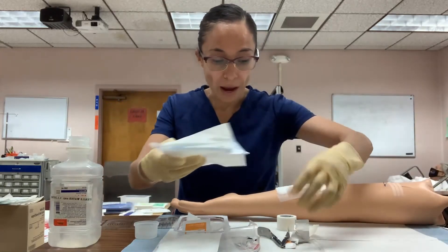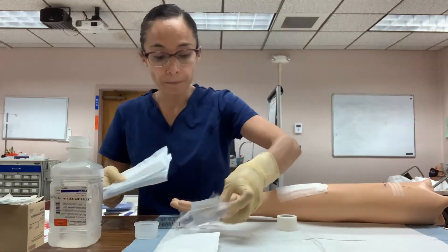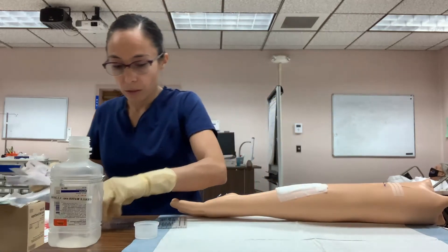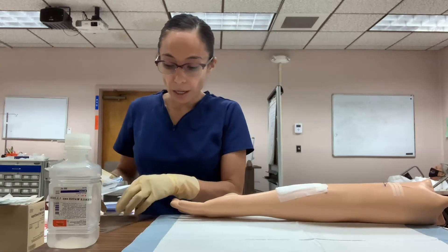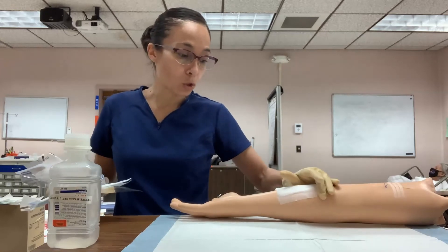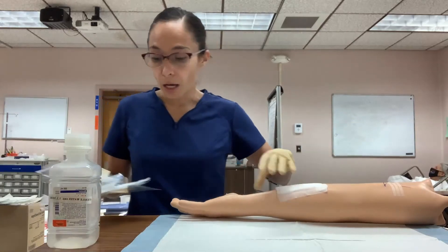Pick up all the trash, count the staples, and discard them in the sharps container. Always check the patient's pain level to see how well they tolerated the procedure. Provide documentation of the incision description afterward to confirm the goal was met and the patient tolerated the procedure. Perform hand hygiene.